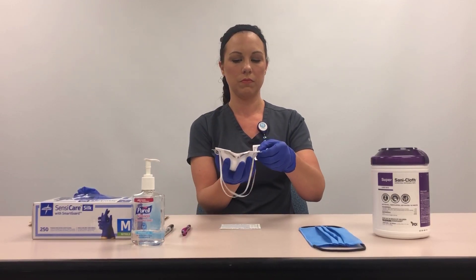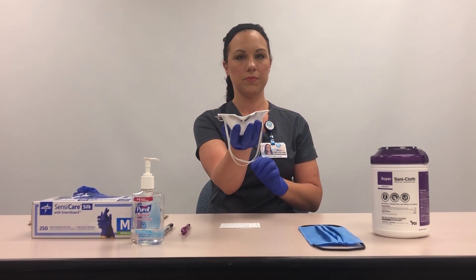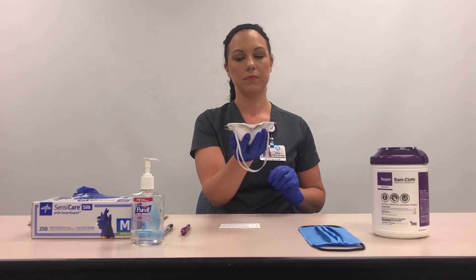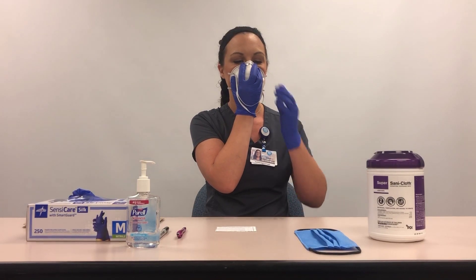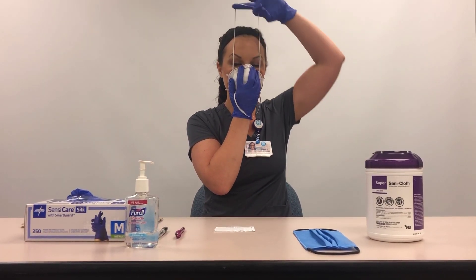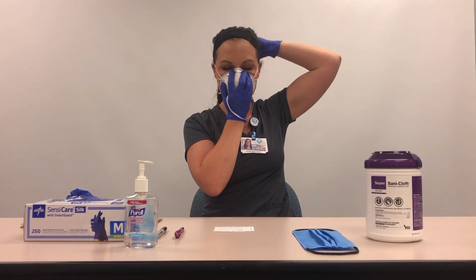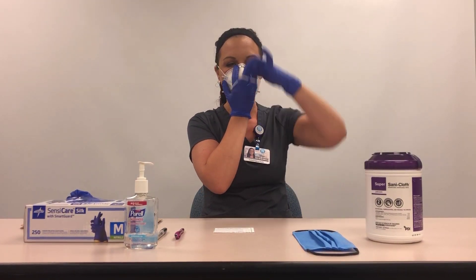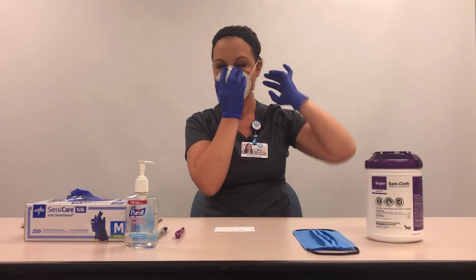Cup the respirator with the nose piece at the fingertips and both headbands hanging below the hand. Hold the respirator up to the face, covering the nose and mouth. Using the other hand, pull the top strap over the head and position high on the back of the head above the ears. Pull the bottom strap over the head until it is positioned at the base of the neck, below the ears.